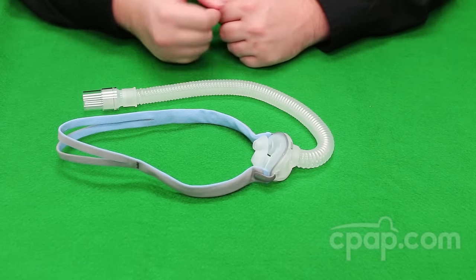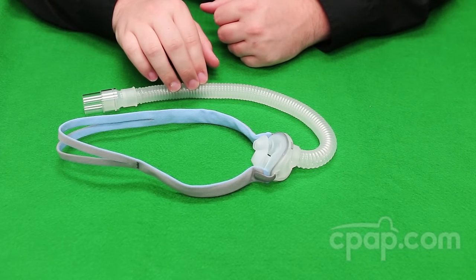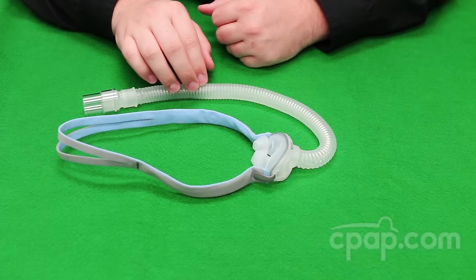Chris here with CPAP.com to talk about the AirFit P10 Nasal Pillow CPAP Mask by ResMed and give tips for assembly and disassembly.